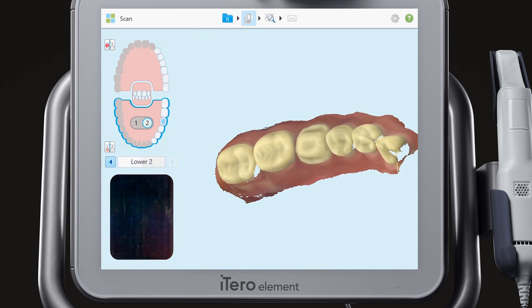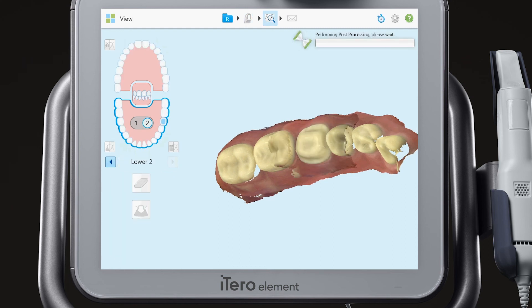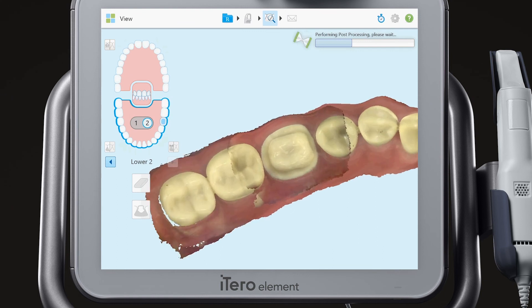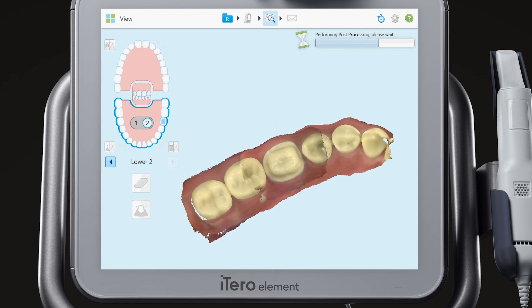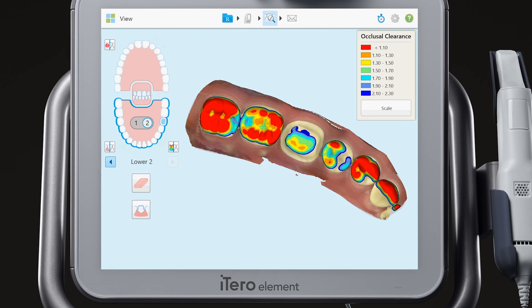When you have completed scanning, tap the view icon. When the case has processed, notice that you can view the pre-treatment scans by toggling between 1 and 2. After you complete your review, simply send the case. The pre-treatment and prep scans will be available to your lab, enabling the creation of restorations that replicate the patient's healthy anatomy and occlusion.